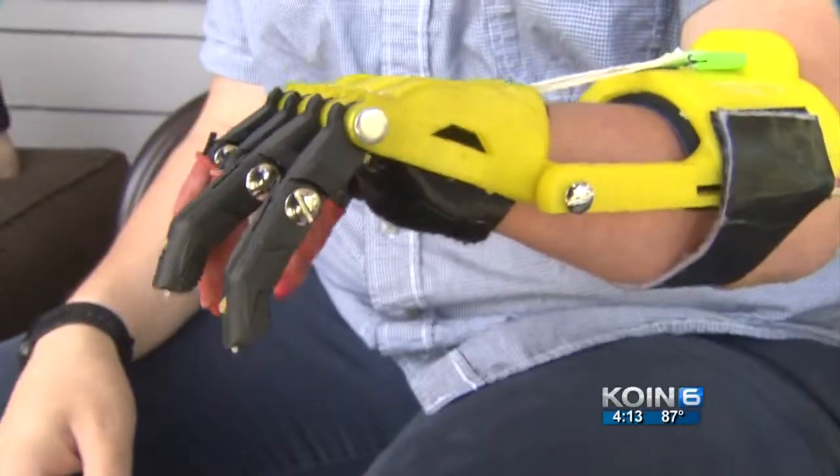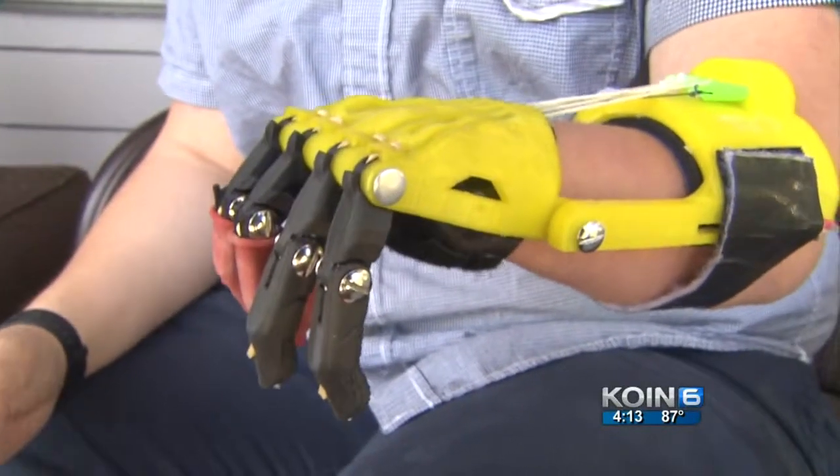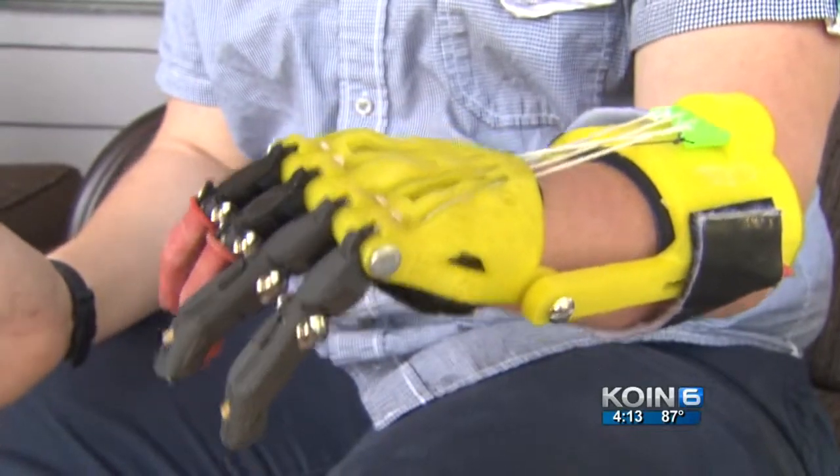Disruptive new 3D printing technology has arrived, and it has been embraced by a Portland man who was born without a left hand, who hopes to turn the market for human prosthetics on its head. One of the biggest things is being able to manipulate something while actually having a hand free.